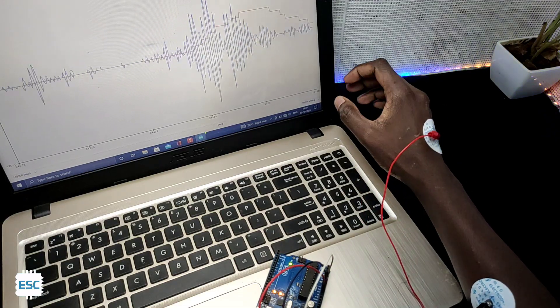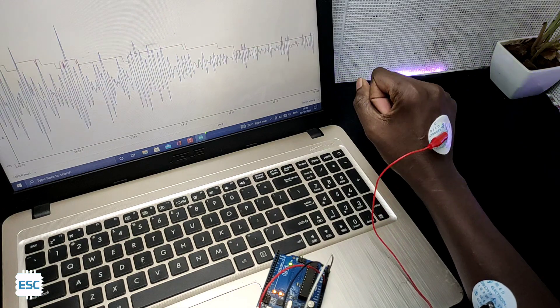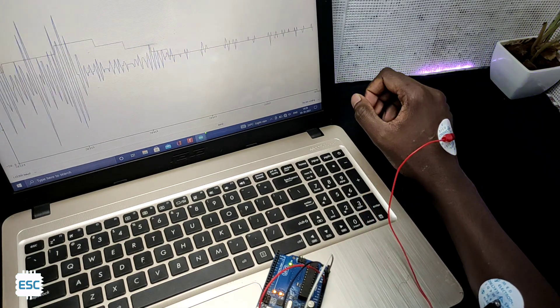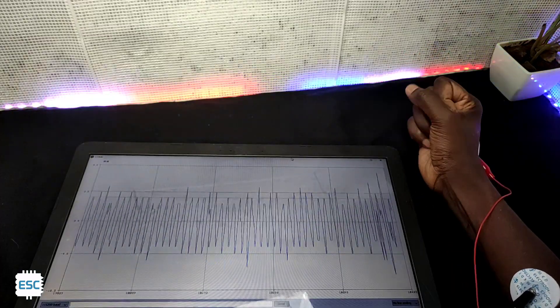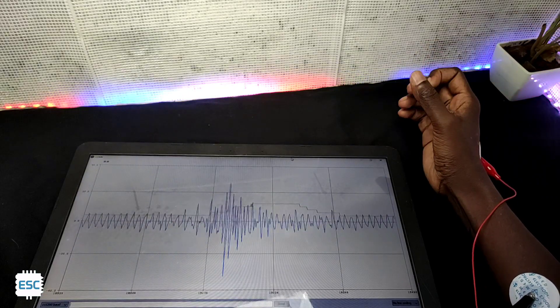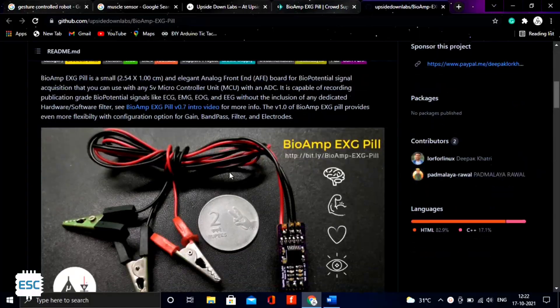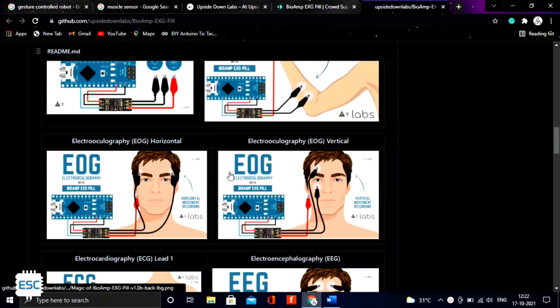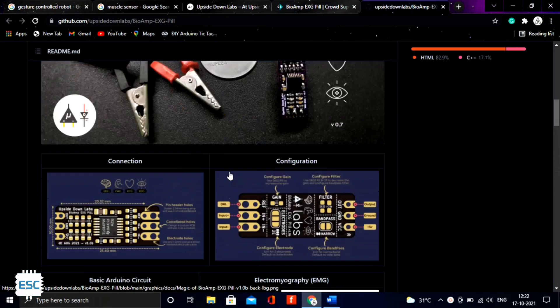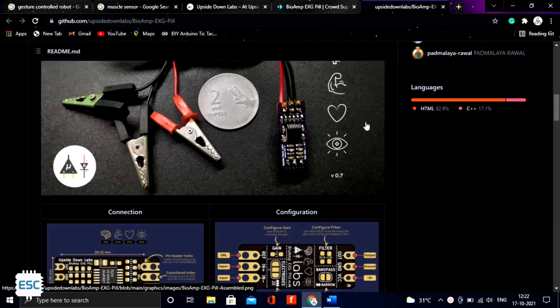In the same way, we can measure ECG, EOG, and EEG with this tiny board. In this video, I just tested the BioAmp EXG Pill. One more thing: this board is open source, so you can download all the circuits and code from their website. In my coming videos, I will make some projects with this awesome pill.